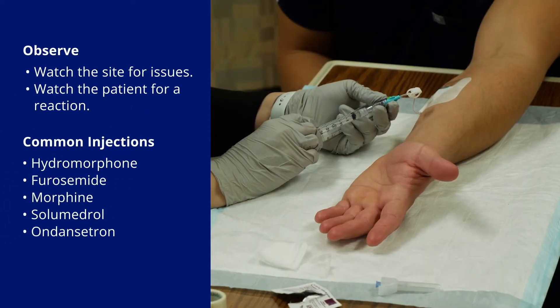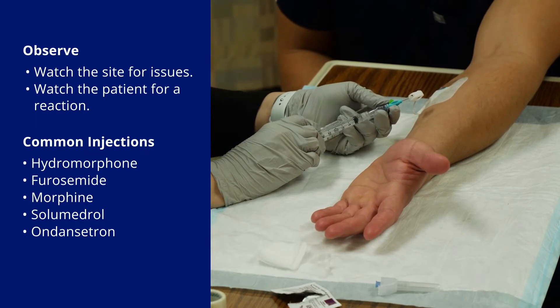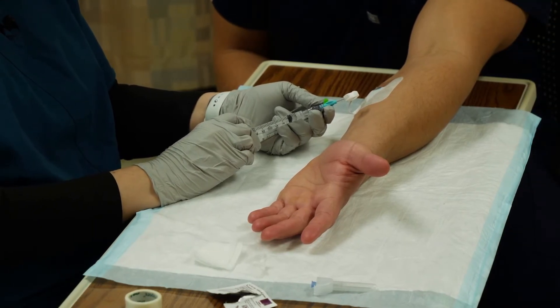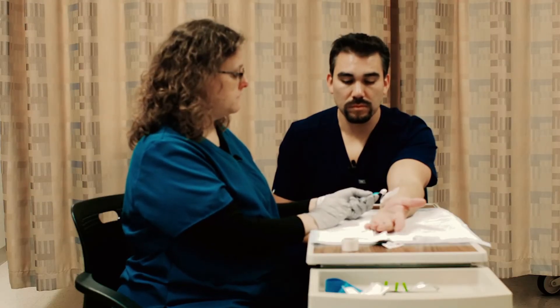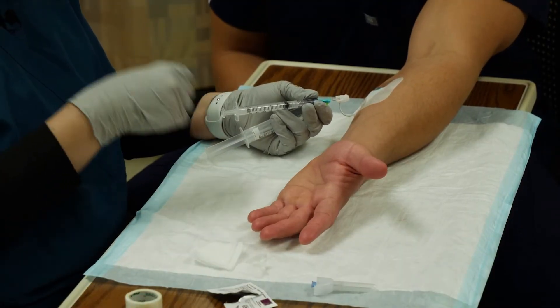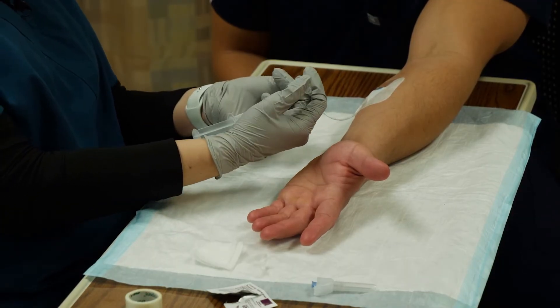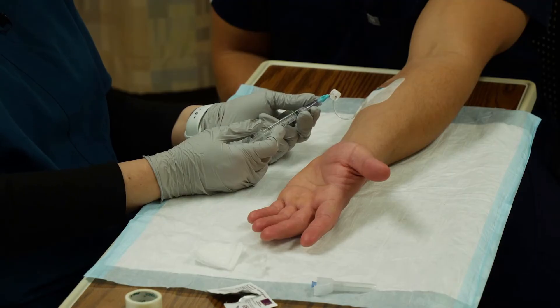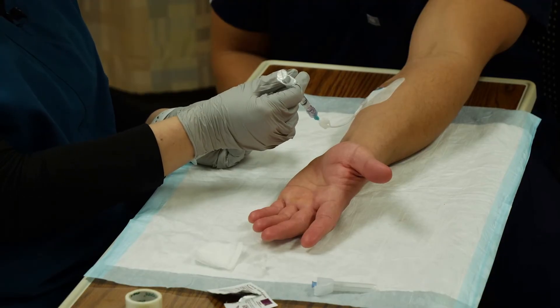So I'm just going to push this nice and slow. You do want to know if your patient has any burning, any swelling, or especially if they feel bad. If this is the first time he's gotten morphine, I really need him to let me know if he's having any chest pain, dizziness, or any other side effects. Now if you are pushing a medication and get busy talking to your patient, and your thumb rests on the plunger, you're going to look down and your whole medication is going to be gone with no idea how long you pushed it over. So when you're not actively pushing, you need to take your thumb completely off of that plunger.